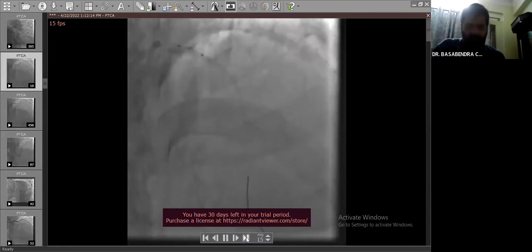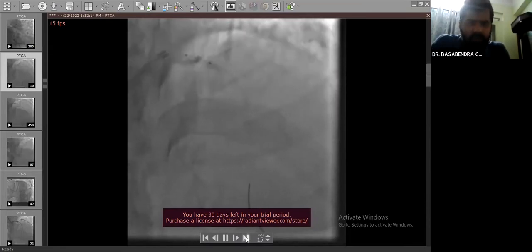and our plan was that we should go just distal to the dislodged catheter tip and give a low pressure inflation and try to pull the thing towards the catheter and see if the tip is coming along with the inflated balloon.